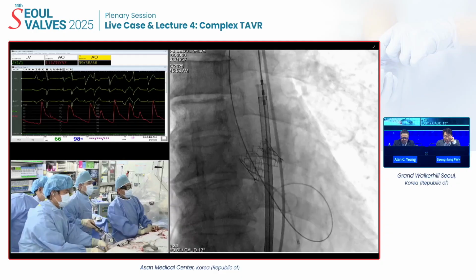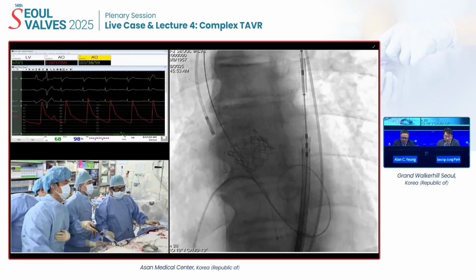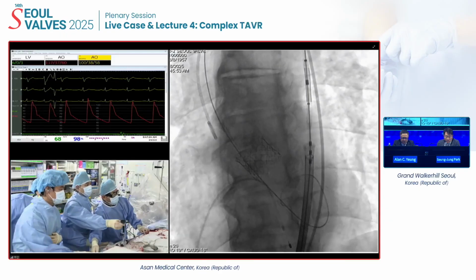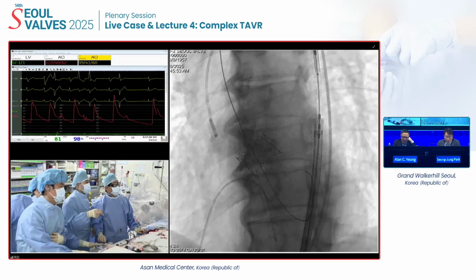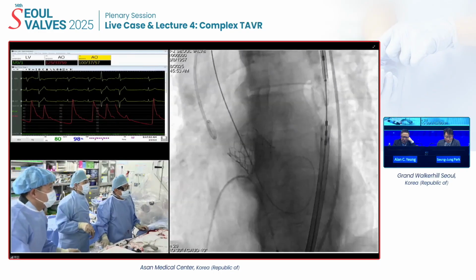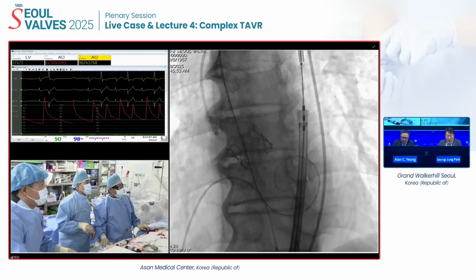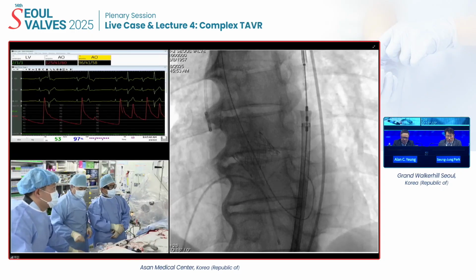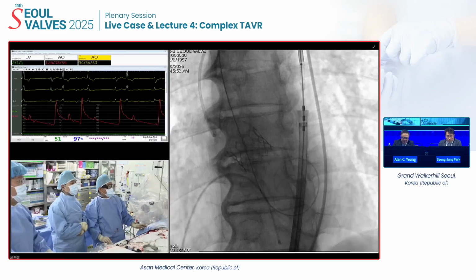0% area of sizing. Around the 5% undersizing. Jung-Min, did you adjust the height of the valve when you were pacing? I saw you pause a little during the deployment, and then you were pacing, yes. That's before the inflation. Minus. You can play that back if you have it. And why did you decide to, maybe for the audience?